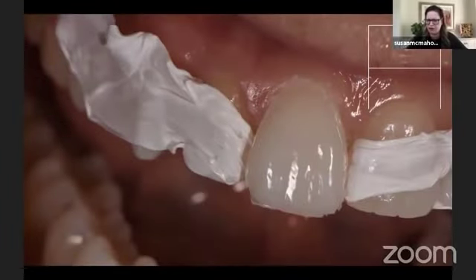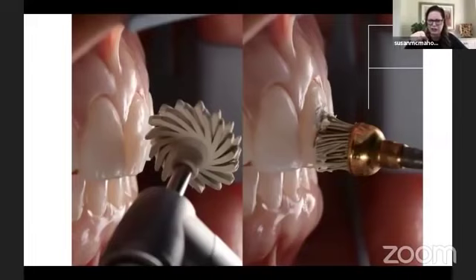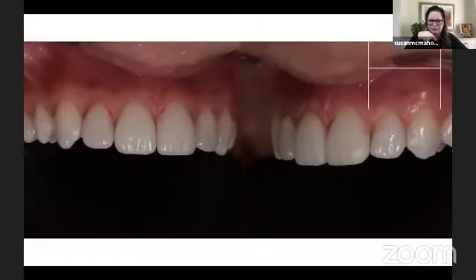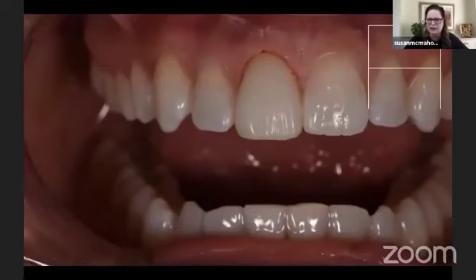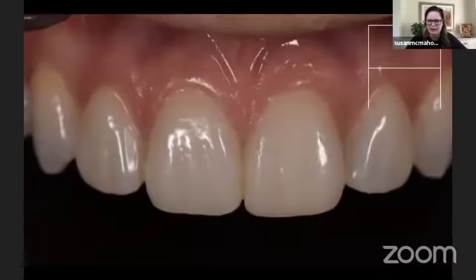So you see it already has beautiful surface texture built in there, but it does have a little excess around the edges. So we're going to take our same finishing. We're going to take that coarse diamond and get rid of the excess. And then we're going to go through our polishing. And it's going to look like that. You see, I've nicked the tissue just a little bit when I was finishing it. And then we're going to go one tooth at a time till we have all four of those teeth done.